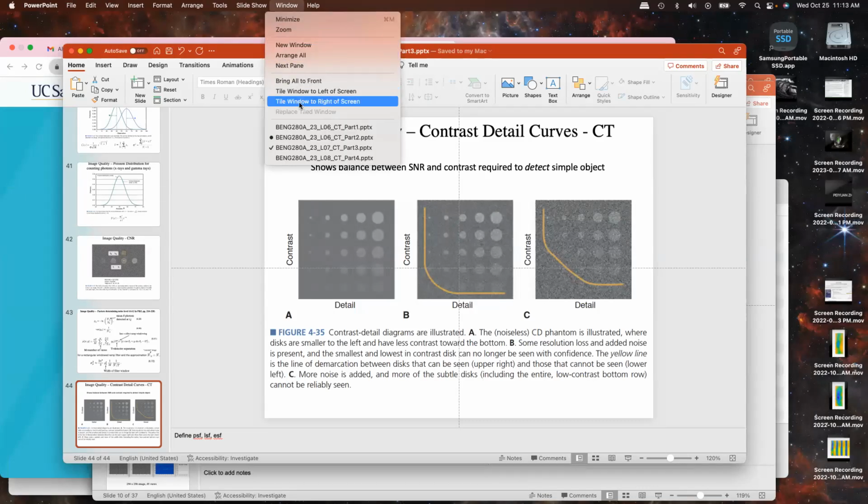Are there any questions about that? If you like, this is a pretty nice, deep example of an electrical engineer getting hold of CT signal processing and deriving what the variance is dependent on. It's a very nice derivation, not trivial to understand, but if you spent an hour or something on it, you could figure it out.